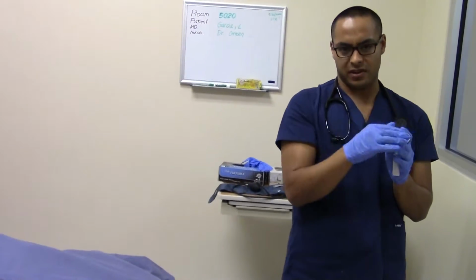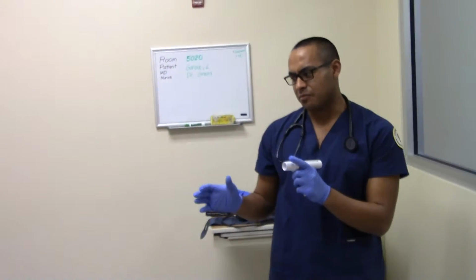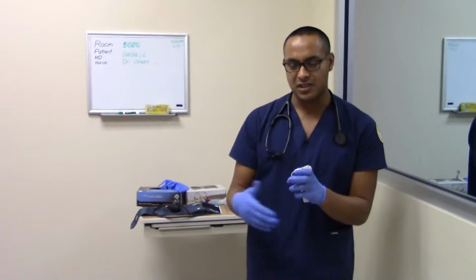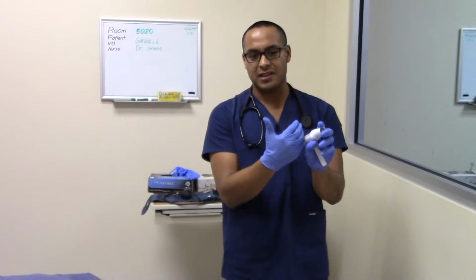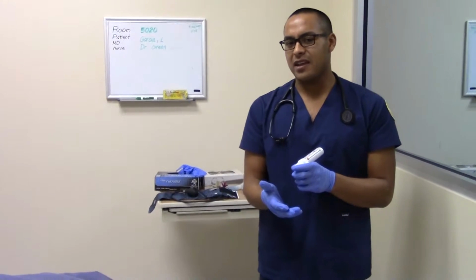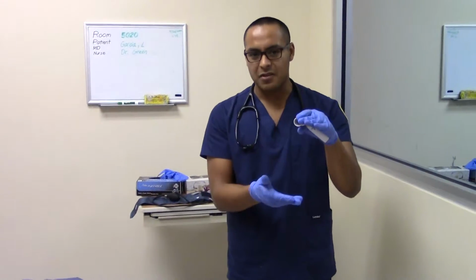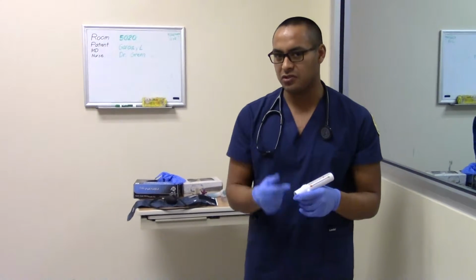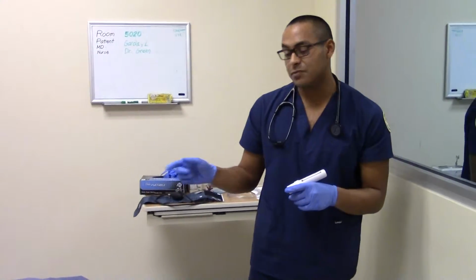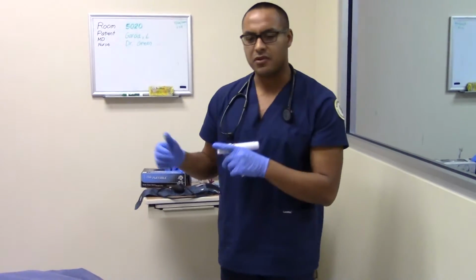Could be an increase, decrease, okay? And then if you feel the patient's attempt wasn't as strong, like if there's a big difference between the first breath and the third breath, have him do it again. Might want to have him rest a little bit because breathing out could really make you feel like passing out. So make sure those 3 are really valid numbers. People look at them and want to really know, are those true? So really do a good job at doing that. I'm still in camera mode, not patient mode.